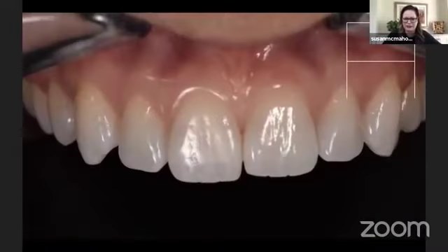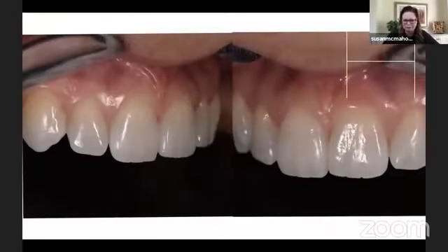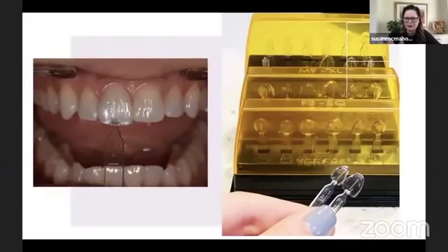And so here she is closer, and you can see that beautiful surface anatomy on her teeth. Now you could take that coarse diamond and build that right in and polish it up with those other two polishers. You could accomplish this with composite if you wanted to, but we just want to make a note of what her surface texture is so we can work toward that goal, right? She's got lateral incisors that are beautiful, but she thinks her smile isn't showy enough and she doesn't like that unevenness. So I'm going to use a product called Uveneer.